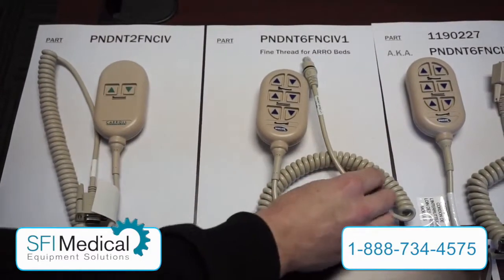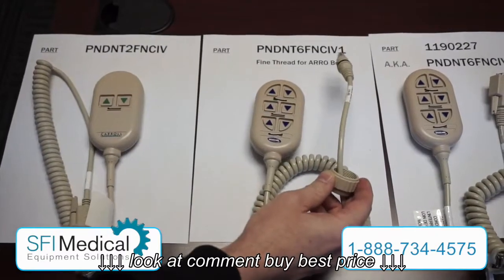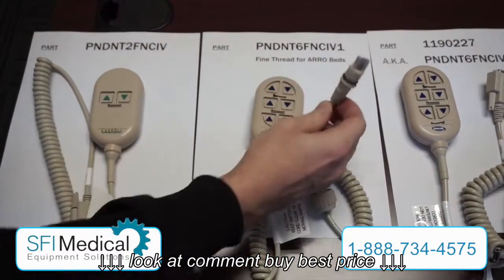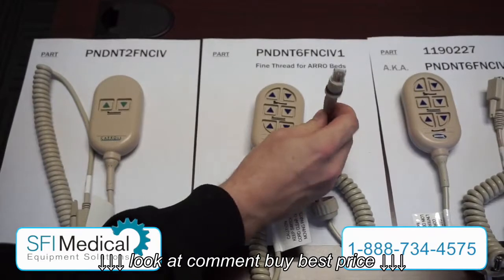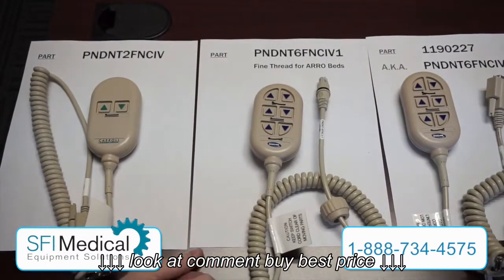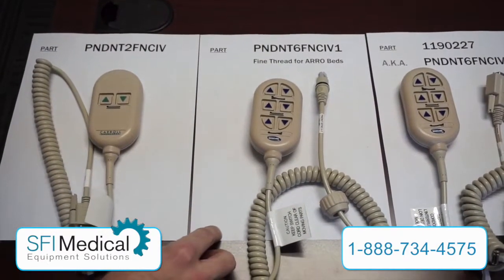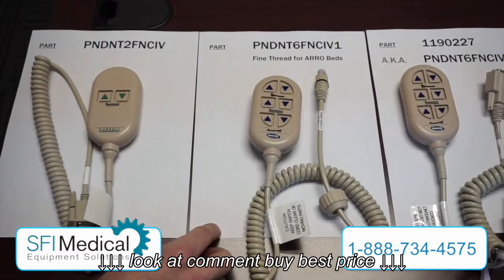Now the fine thread gets its name because of the screw connector cap. The threads are finer than all of the other pendants. This only comes in the RJ45 standard connection, and it has the coiled cable, and it's only available in the 6-function version, and it will only work on aero beds. So it's important to check your serial number to see if you have the fine thread or not.